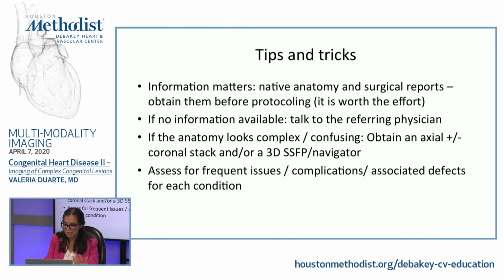So for patients who had surgery a long time ago, you need to challenge the diagnosis. You cannot just go with what is being told to you. When you have doubts, get an axial or a coronal stack or a navigator to get a full 3D assessment of your anatomy and provide an accurate diagnosis.